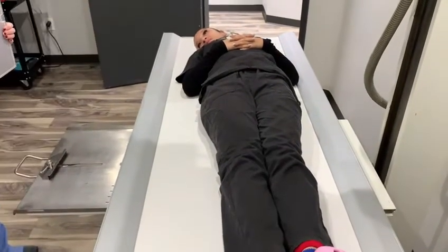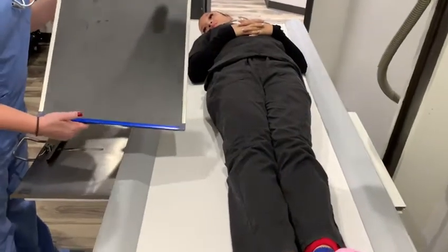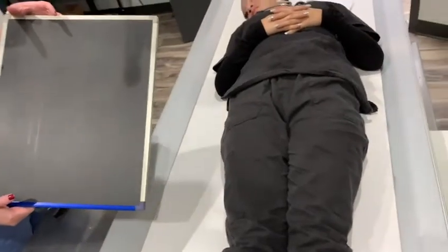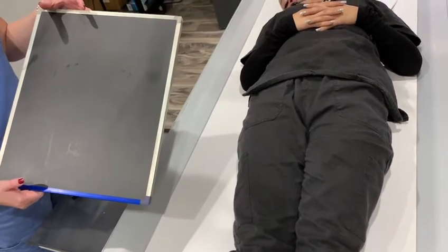So this one is for Monica, she's been waiting for this one. We're going to do a lower back lumbar spine. I'm just going to show you guys the two images first. Most likely they'll only want the two images instead of the five.